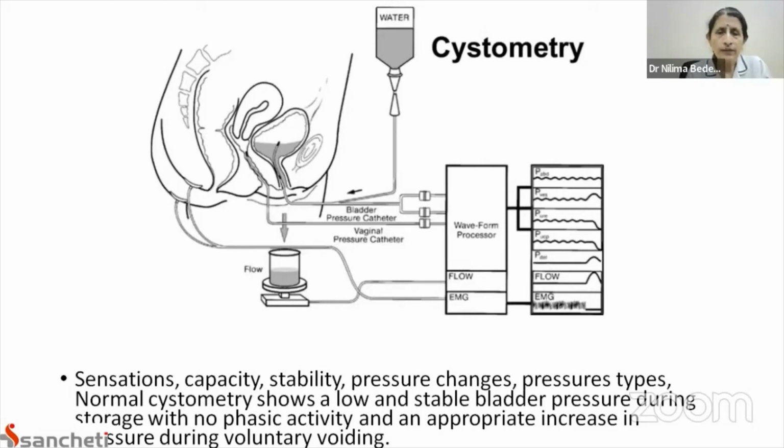Slowly the water or a special fluid is being put into the bladder. So the person is in a semi-reclined position and looks at the screen very well. So this gives a great idea about the bladder sensation, the bladder capacity, the stability of the bladder, and the pressure changes, the pressure types. So all this can reveal a lot.